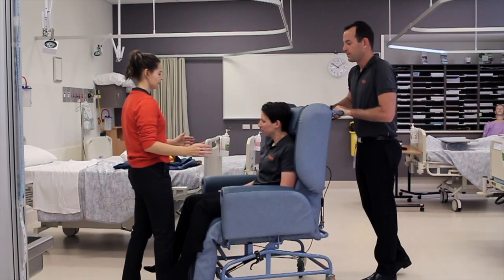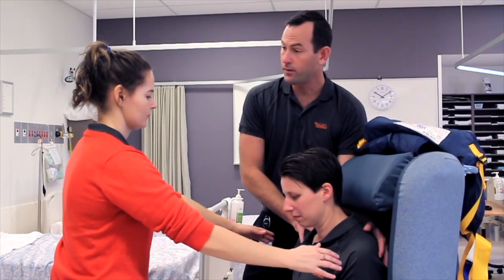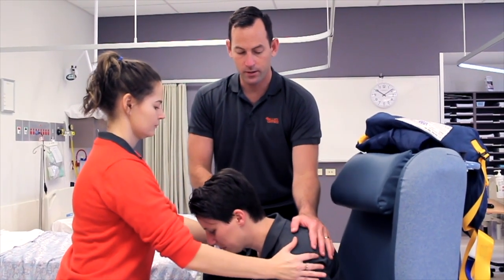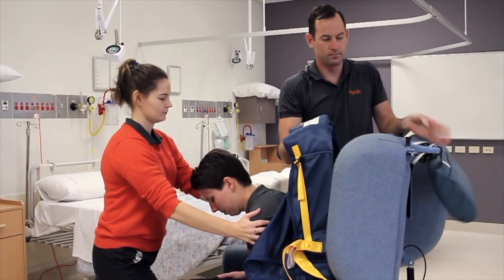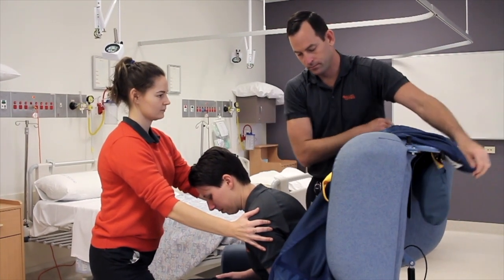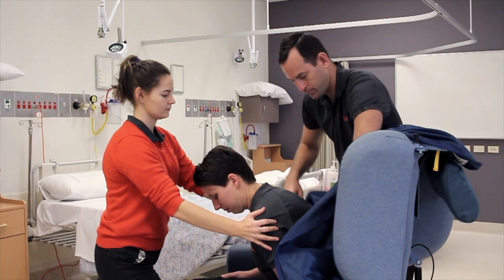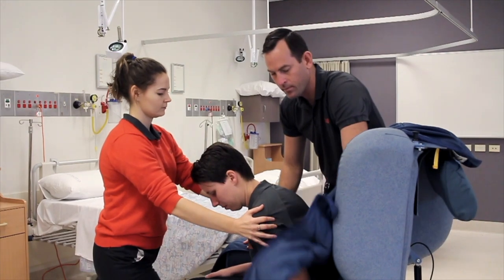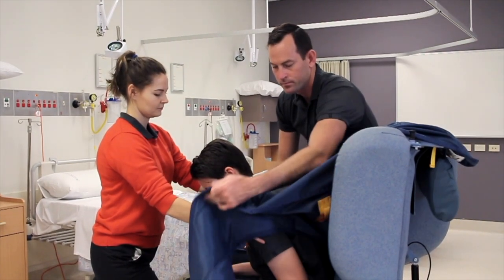To lean the resident or consumer forward we'll use the pneumatics of the chair. The person from behind will assist the client forward and stabilise them in a forward position. The staff member will position the yoke frame sling down the back of the client or consumer, making sure that the arch of the leg straps fits just at the back and around the bottom crease of the client or consumer.